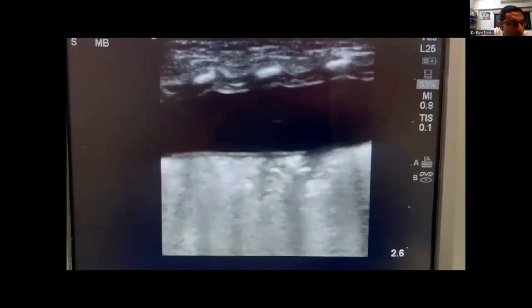I mean, a few things about the fluid here. It is not echogenic fluid. It is very uniform. I cannot see any fibrin strands in it. It would favor a transudate as opposed to an exudate, but it is not definitive. And the only way that you can really differentiate is by formally doing a tap.